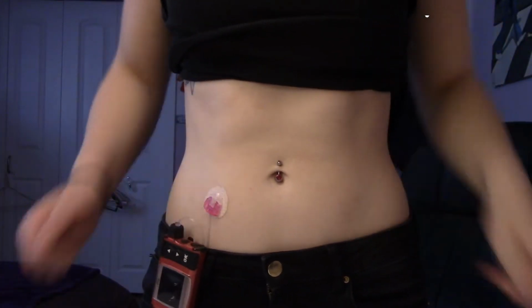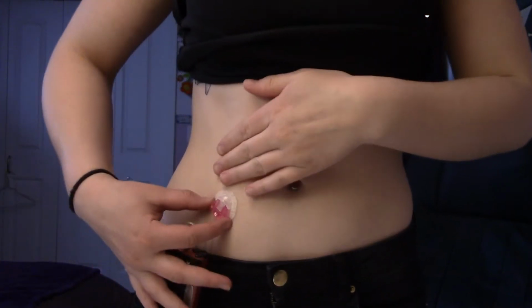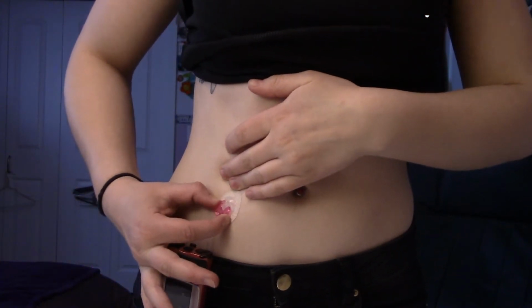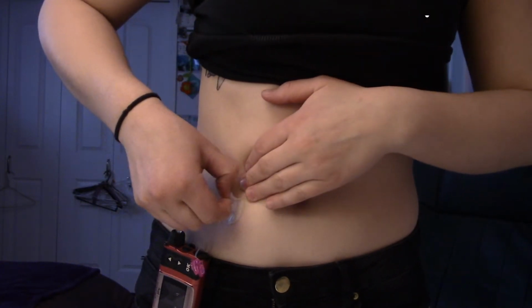Okay, so don't mind my stomach, guys, sorry. But for this next part, what we're going to be doing is we're going to be taking off our old insertion site. So all I'm going to do is unhook this pink part here, and then I'm going to take off the previous insertion site that had been there.